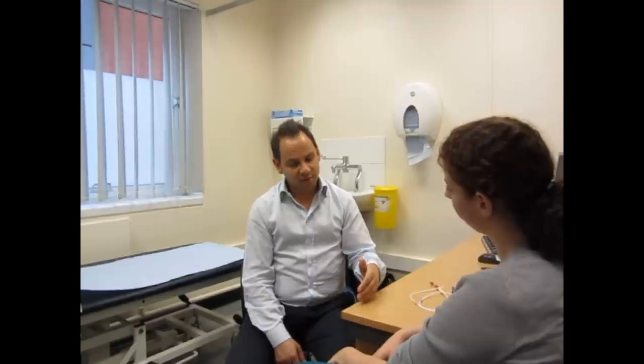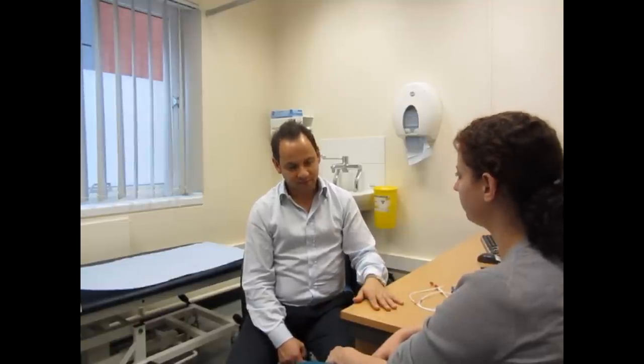There is also another way of doing it, and that's via a graft, a prosthetic graft. And that's a piece of plastic tubing going from an artery to a vein. And that's something that we can discuss if the need arises at a later date.